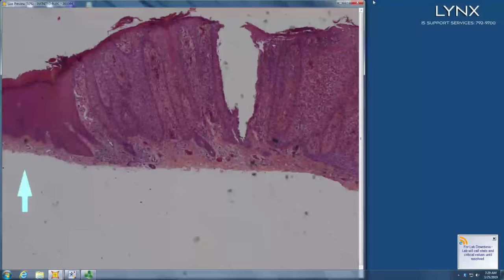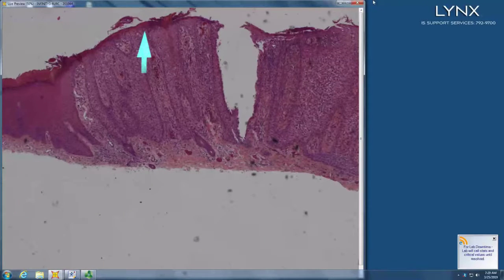Yep, clear cell acanthoma. Always has a neutrophilic crust, always has neutrophils, typically with karyorrhexis, within the clear epithelium, abrupt cutoff from the surrounding epidermis.